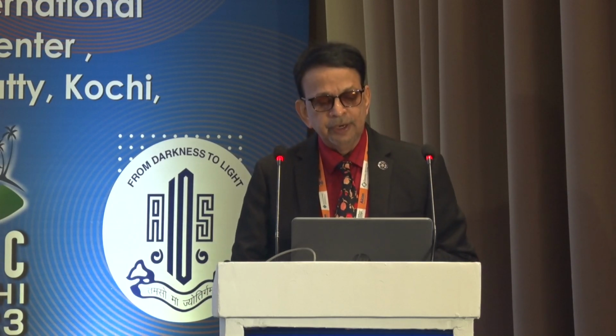I'm doing what is called a vertical chop. There is no horizontal chop in this, because for a horizontal chop, what you do is go underneath with the blunt chopper, underneath the capsular recess, and come from the periphery. The vertical chop uses a sharp chopper, you can see here, chopping right in front of the rhexis margin. So in small pupils, it's always better to use a vertical chop, because it's not a blind technique. You visualize each and every step there.